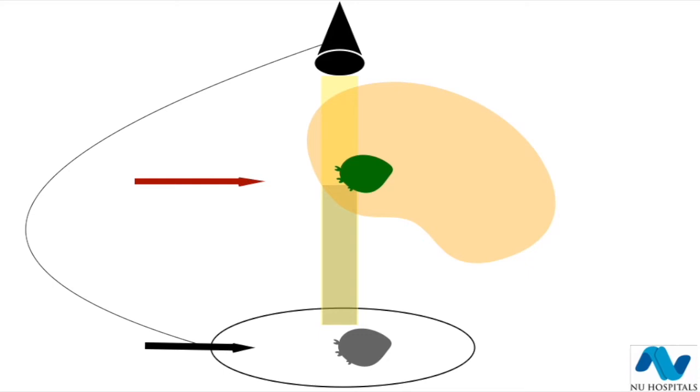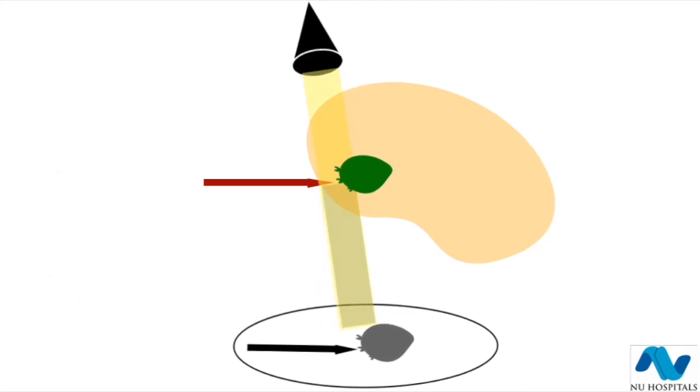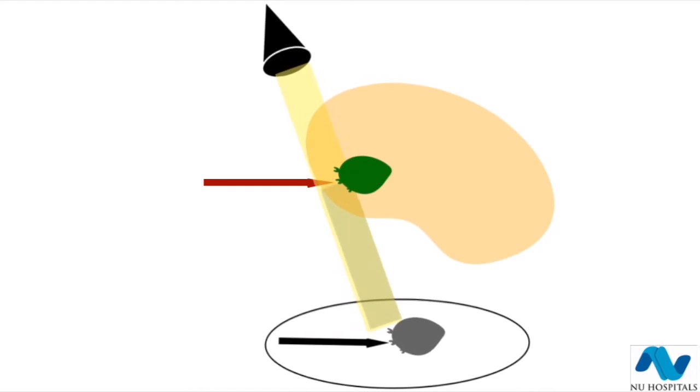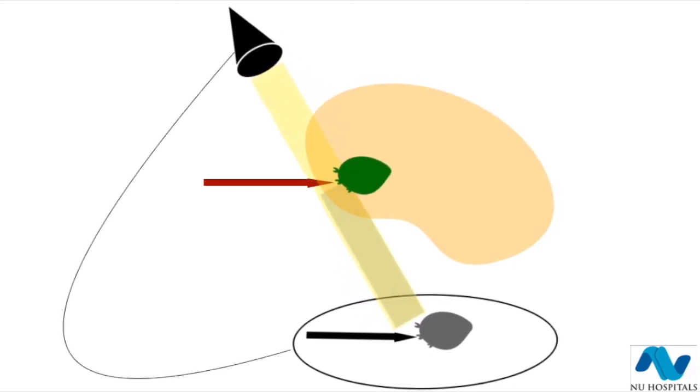For the first puncture let me assume that we are pointing at the correct depth. As the tip of the actual needle reaches the tip of the calyx in the patient, what we see on the fluoroscopy screen is the tip of the needle pointing at the edge of the calyx. Now we have said that we are at the correct puncture. So when we turn from 0 to 30 degrees towards the surgeon, this relationship between the tip of the needle and the edge of the calyx is maintained.